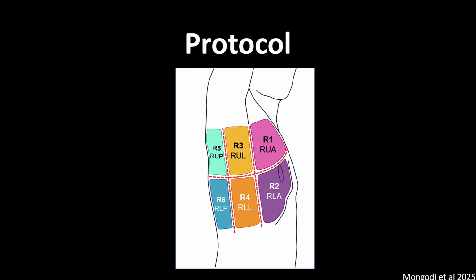Similarly, there are many different lung ultrasound acquisition protocols reported in the literature. These range from a rapid 2-zone protocol to the thorough yet more labor-intensive 16-zone protocols. Probably the most famous protocol is the Blue protocol, as outlined by Dr. Daniel Lichtenstein. This 12-zone protocol has recently been recommended by the 2025 ESICM Consensus on Quantitative Lung Ultrasound. Each point evaluates a different part of the lung. I often toggle between this and an abridged 8-zone protocol when scanning patients.